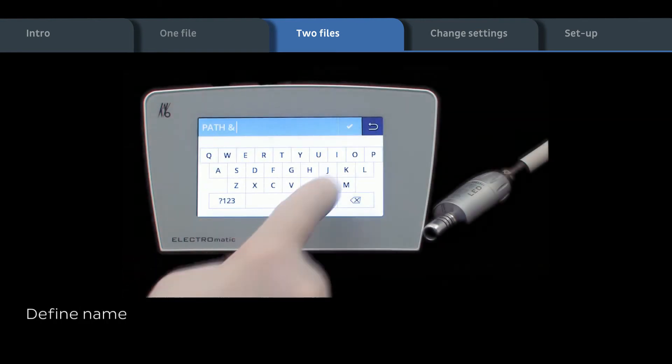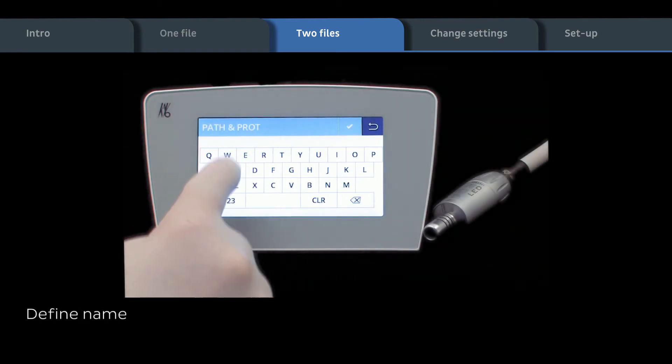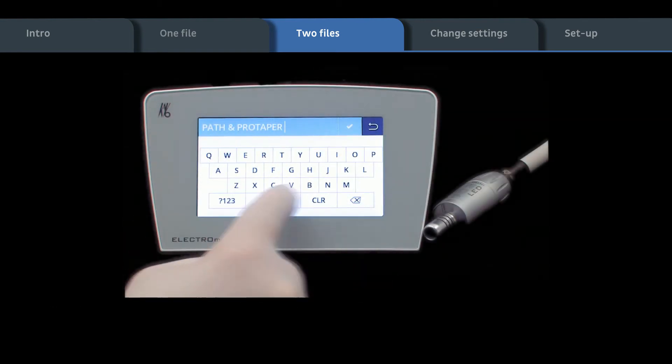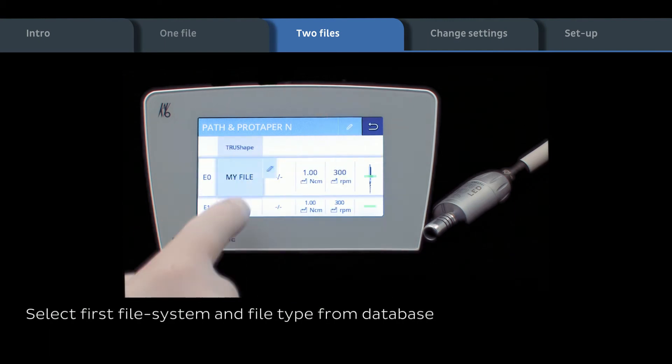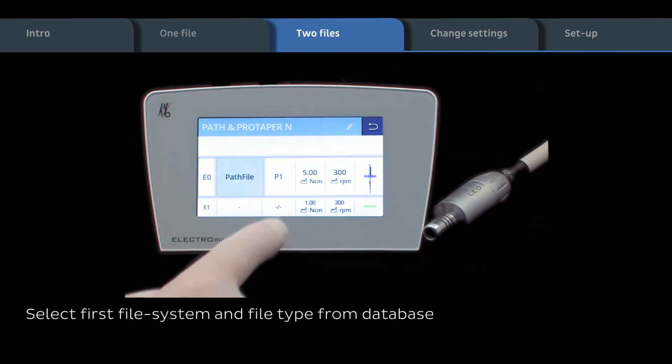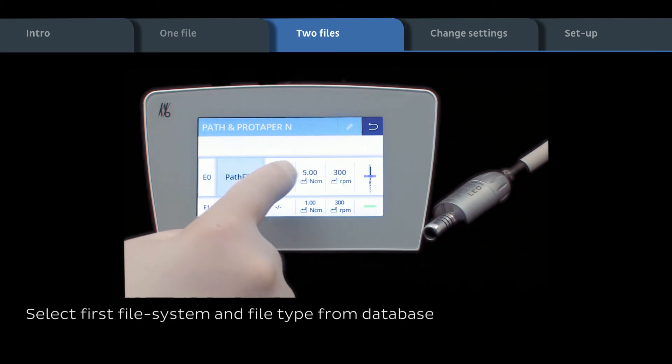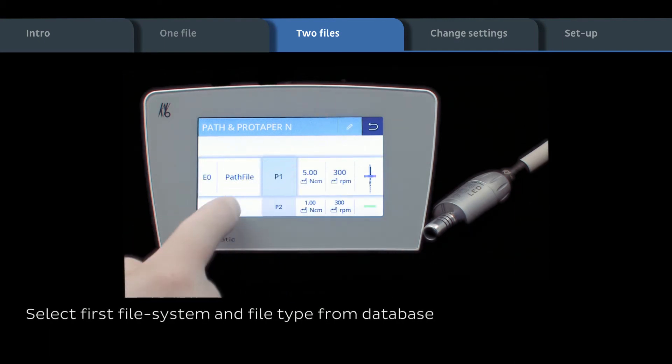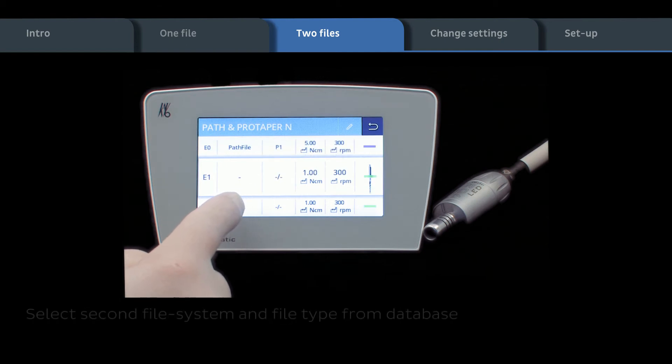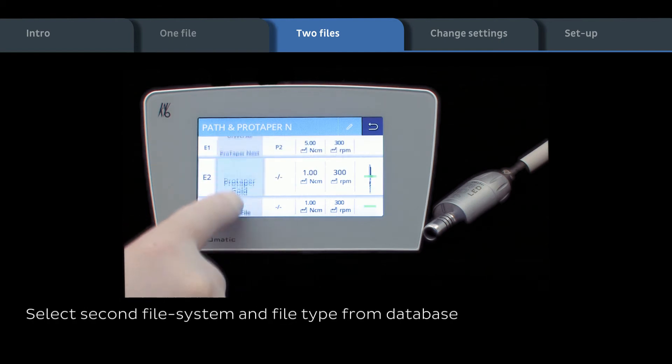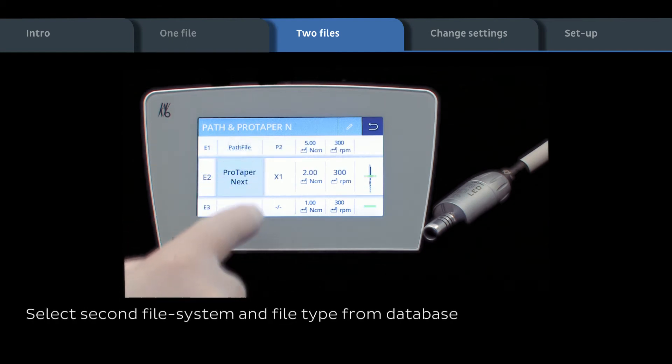Define name of workflow sequence. Select first file system and file type from database. Select second file system and file type from database.